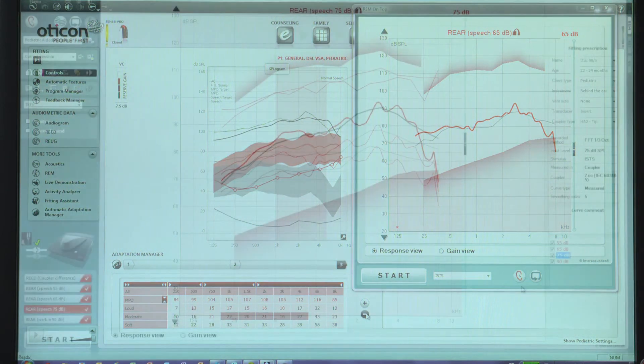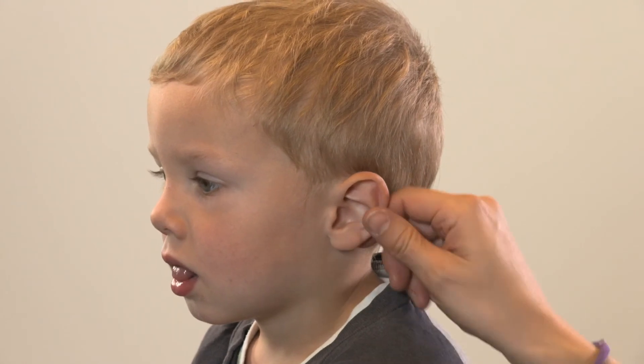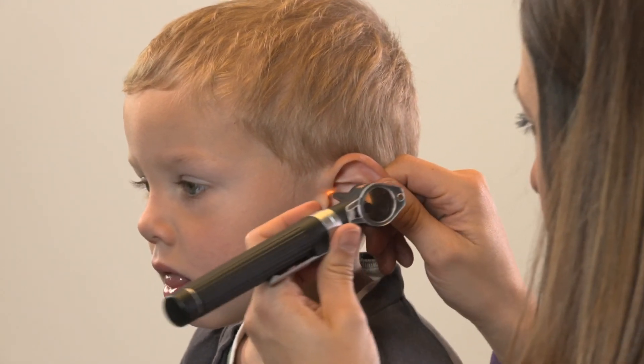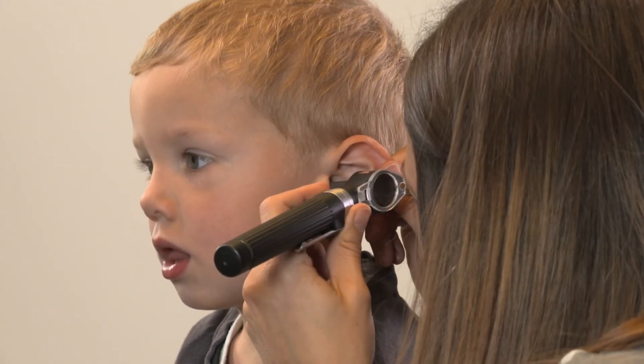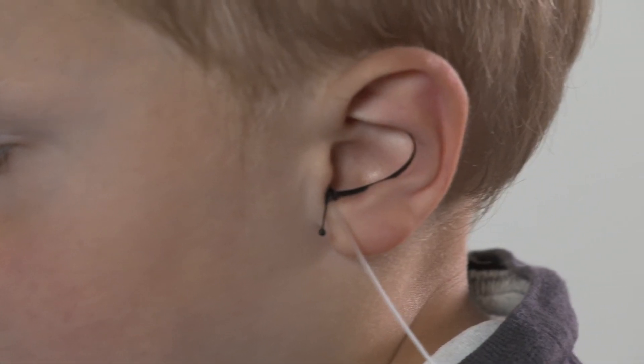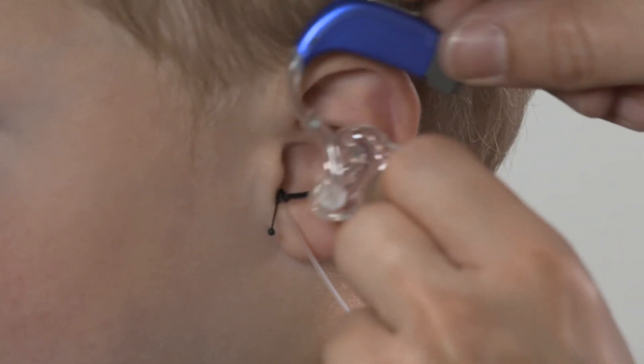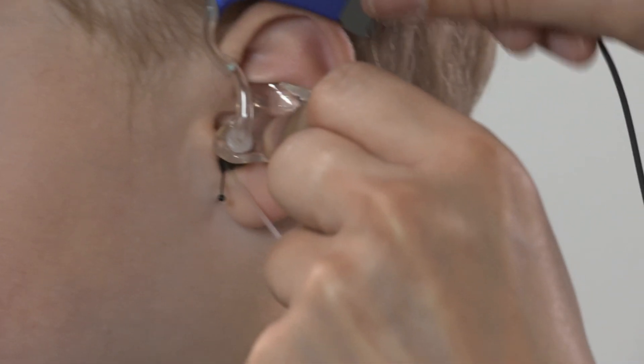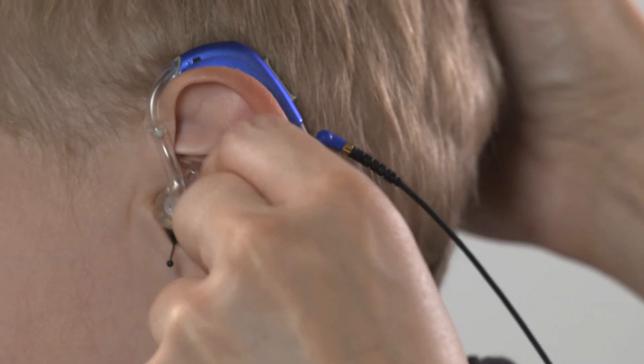Finally, once all levels have been measured and the responses are matching the targets, the hearing instrument will be ready to fit to the child. Remember, if no measuring equipment is available or a lack of time is a concern, the EZ RECD tool available in Sensei Pro is an alternative for measuring individual ear acoustics.